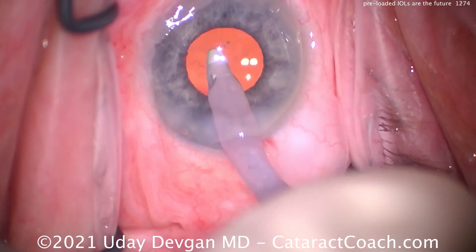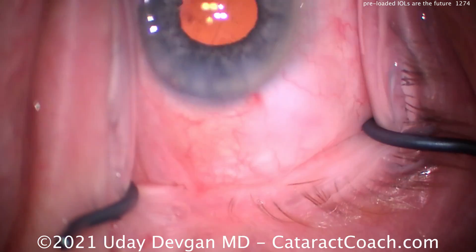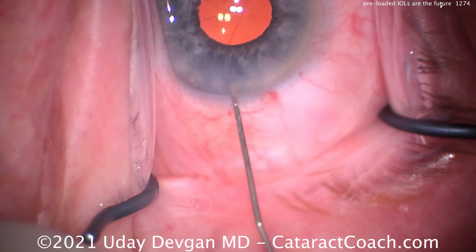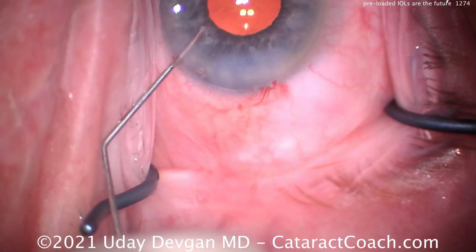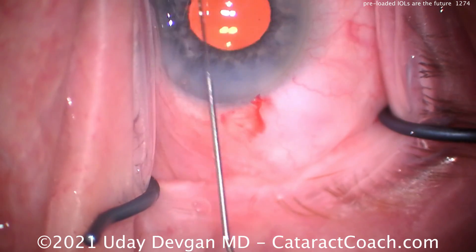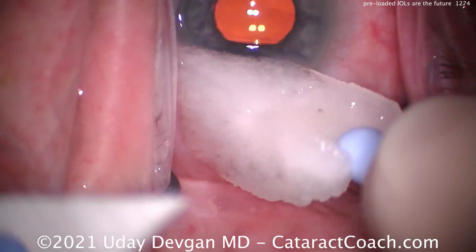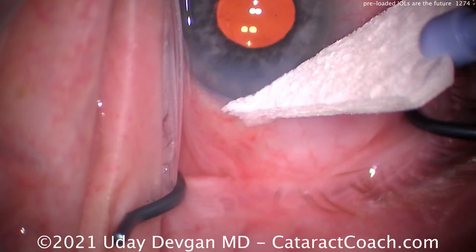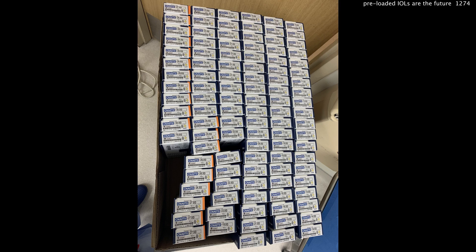I encourage you to try all the lenses — I like all the manufacturers and I like to use all the lenses. Of the lenses we're using now, we want to switch almost all of them over to preloaded. I like this new Clarion lens. I've also been using the iHance Toric, which comes preloaded as well — a different type of injector, more of a plunger style. Bausch & Lomb also has a very nice injector system. The more manufacturers that give us these products, the better — we want variety to tailor the best option for each individual patient.